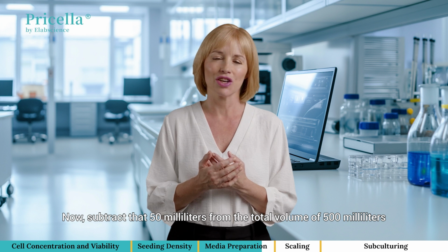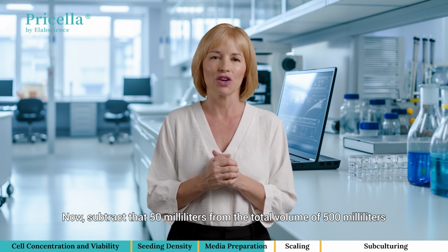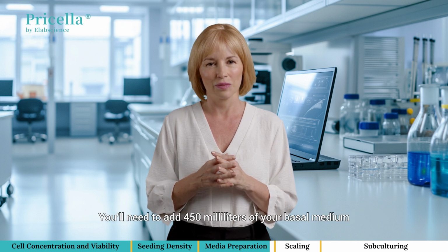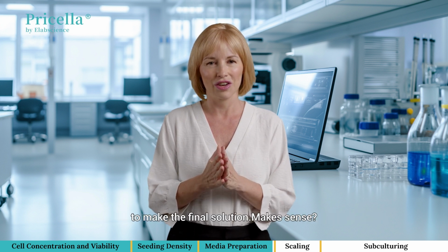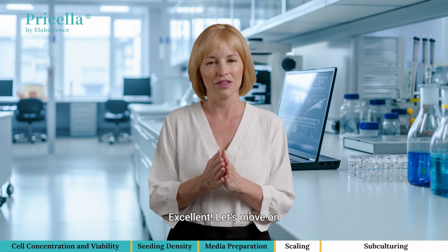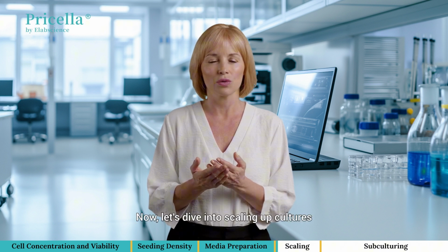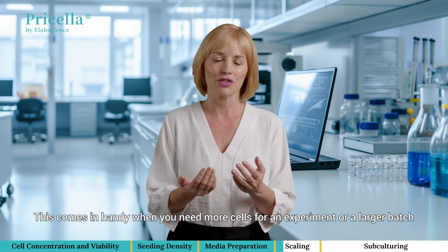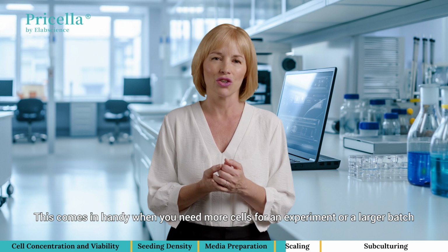Now, subtract that 50 milliliters from the total volume of 500 milliliters. You'll need to add 450 milliliters of your basal medium to make the final solution. Make sense? Excellent. Let's move on. Now, let's dive into scaling up cultures. This comes in handy when you need more cells for an experiment or a larger batch.